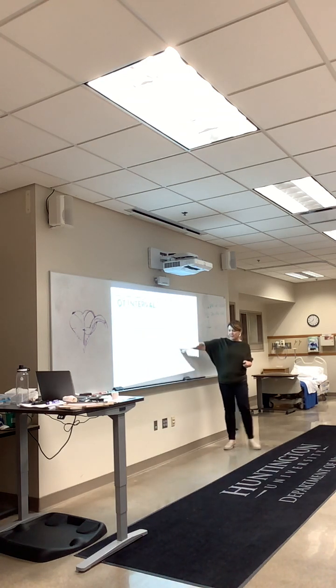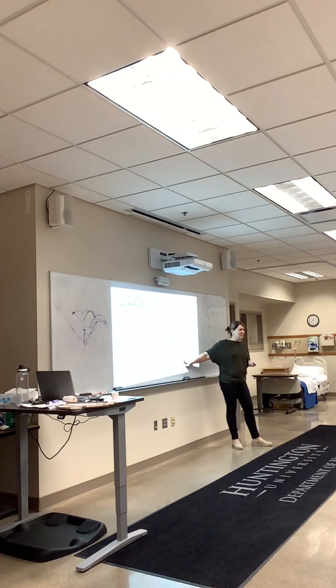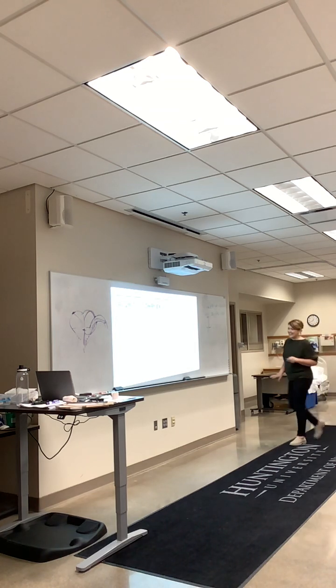QT, I'm not going to make you measure this one. Did you know that there's sometimes a U wave? Okay, U waves, we don't mention it very often. There's certain conditions that can create a U wave, and some people just naturally have a U wave. We don't measure it, we don't count it, we kind of ignore it unless you work in the cardiac unit. Then you can worry about that. So right now, forget that ever existed for this class. Right. Just back to here.